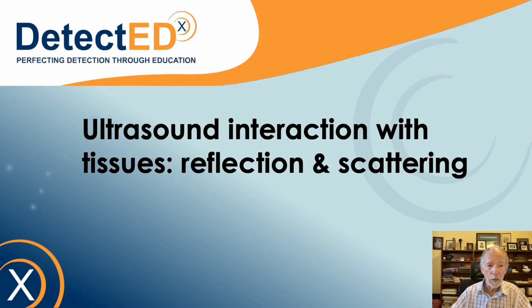Hello, we're now ready to talk about the reflection and scattering of ultrasound by structures in the tissues. I've already mentioned these are particularly important because these are the mechanisms that give rise to echoes, and the echoes are the information used to create the ultrasound image.